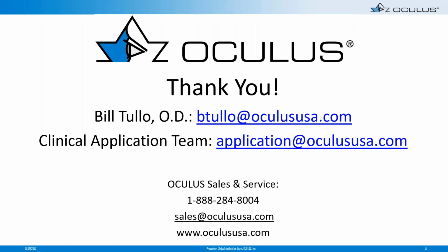It's really important that we get good data, but fluorescein should not be put in the eye before a Pentacam scan. And if it is, you should wait at least 15 minutes, and I would put artificial tears in every minute or so just to reduce the fluorescein in the eye, because that will reduce significantly the ability to edge detect also.